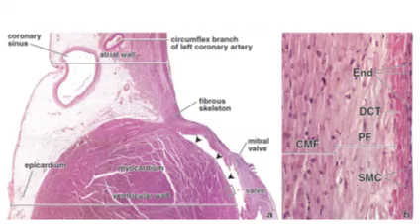Let us see an H&E section of the heart. This is how the heart looks. This is the most outer layer, which is the epicardium, and I have to mention that the epicardium contains the blood vessels which supply the heart. I mean the veins, the major vein being the coronary sinus, and the arteries, such as the circumflex branch of the left coronary artery. All the arteries which supply the heart are found within this outer layer, the epicardium, and this is the flattened or simple squamous cells of the epicardium.